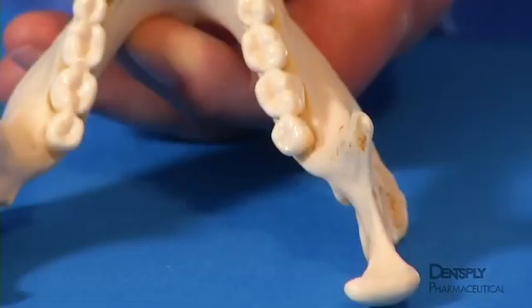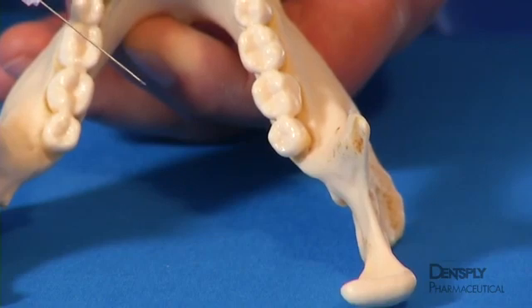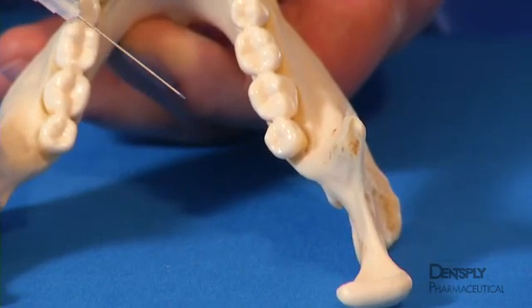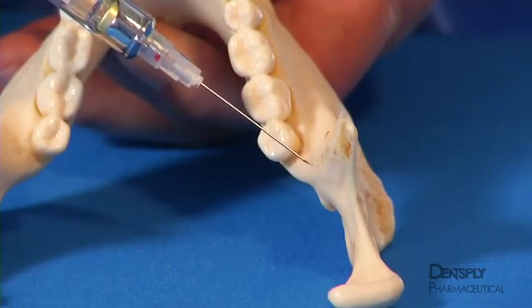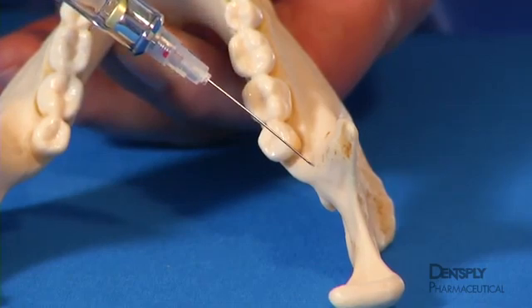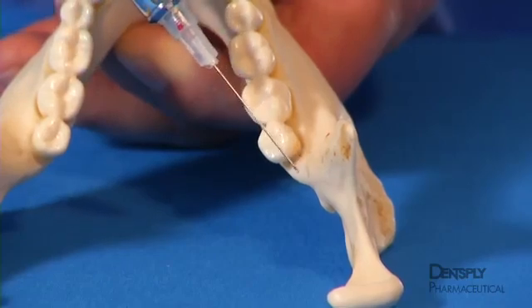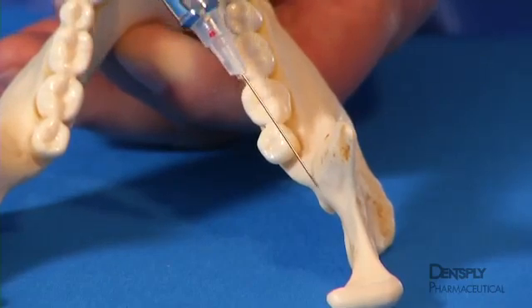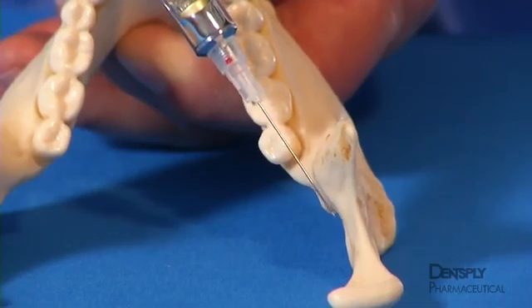To ensure that bone is contacted during the second injection, the insertion point can be moved slightly more lateral to the pterygomandibular raphe as the syringe is oriented over the contralateral mandibular first molar region. Then, when bone is contacted, gentle repositioning of the syringe and probing with the needle until it is felt to drop into the mandibular sulcus can be performed.